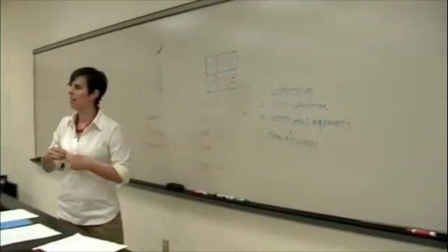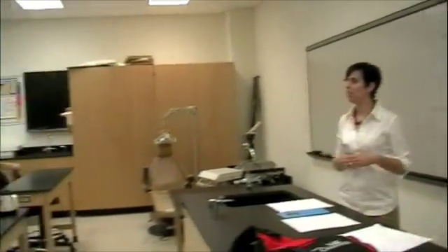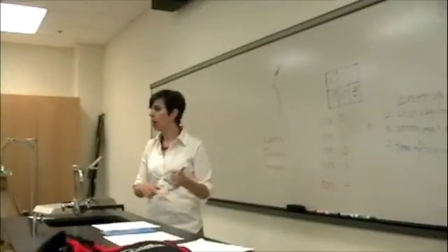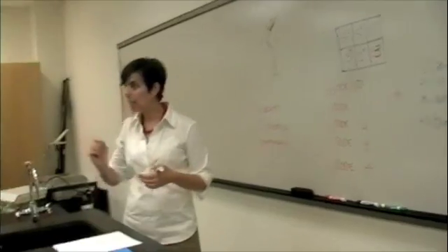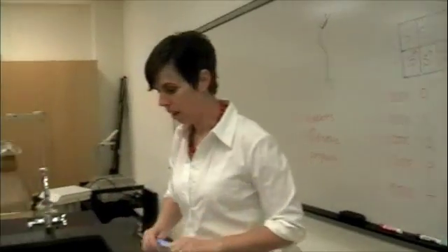Yeah, Emily, did you have a question? Maybe time efficiency. Yeah, definitely. Faster. That's a big one. You guys haven't done this a whole lot as students, where you've got 4 hours to clean somebody's teeth. But when you're in an office and you've got 45 minutes and your last patient was 15 minutes late, and now you've got somebody in your chair and you know you have to probe. It is mandatory to probe somebody's mouth. You can't skip the probing. This is a great way to get there, and you're satisfying the dental legal requirements, and it's saving you time because you don't have to write down every measurement. And you're still doing a great screening. So that's awesome. Good job, guys.